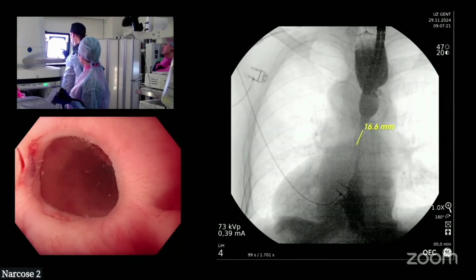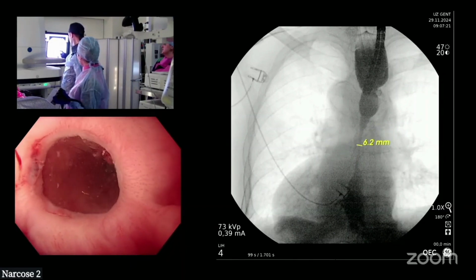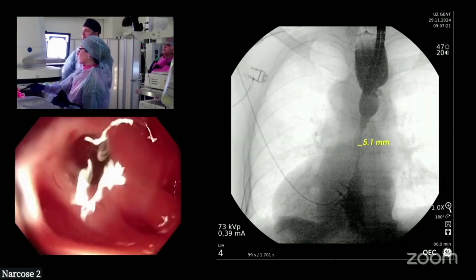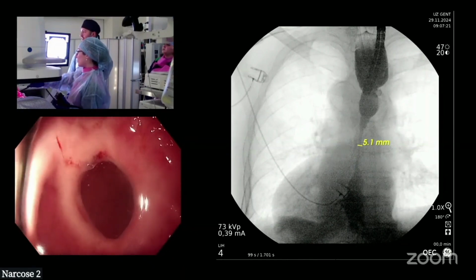Do you think this is very, very accurate, this? And if not, why not? I mean, it's hard to get there. Like, yeah. It's going on the fact that it's probably something like 5 or 6. Look in the distance. Take out that fluid so we can see. Can we reprioritize the endoscopy image, please?